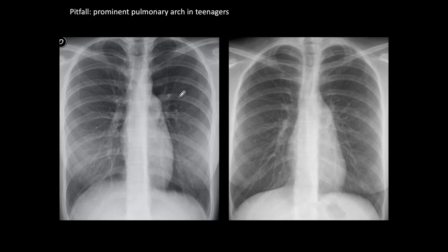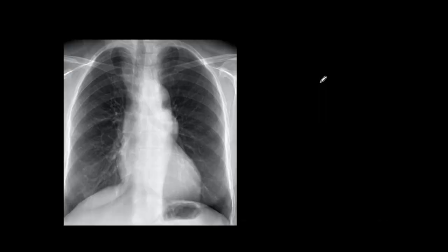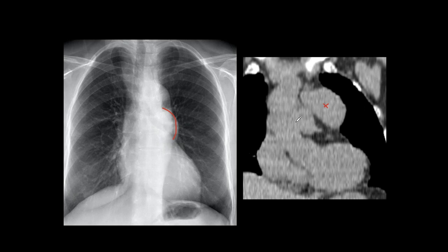Pitfall: it is normal to see a prominent pulmonary arch in teenagers. This is a common finding, probably due to thymic tissue, and should not be suspected as abnormal. For anyone under 25 with this finding, call it normal. The other pitfall is a tumor in front of or behind the pulmonary artery that may simulate pulmonary artery segment convexity. Here it was due to a thymoma — the patient was asymptomatic and it was proven to be a thymoma after the chest X-ray was taken.